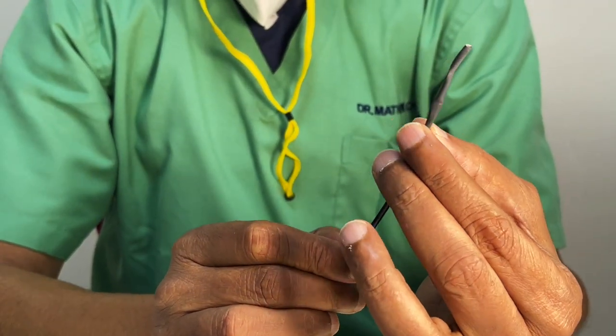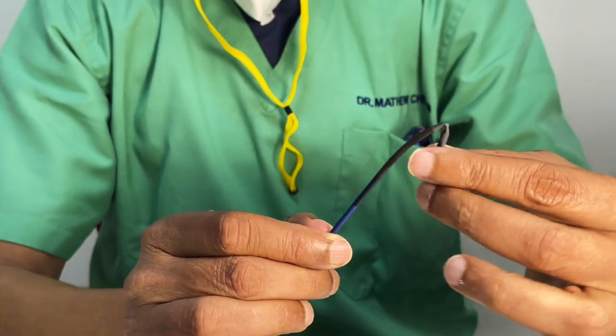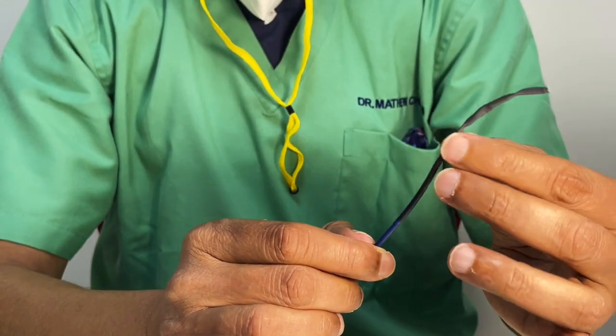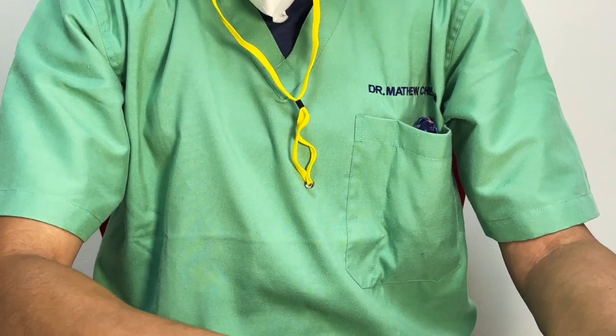As long as there is no tight loop, there is no problem. It will go. But if you're going to go into something where the loop is going to be like this, you know, in a tonsillar loop, it's going to be pretty messy. Not a great idea. And honestly, we would still say it's not a great thing to use.